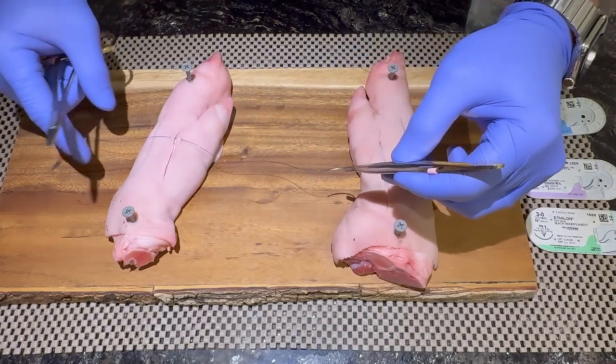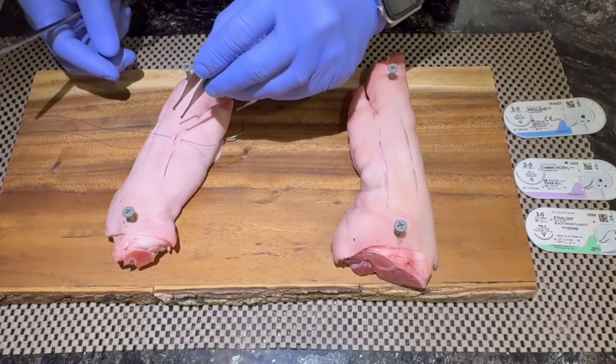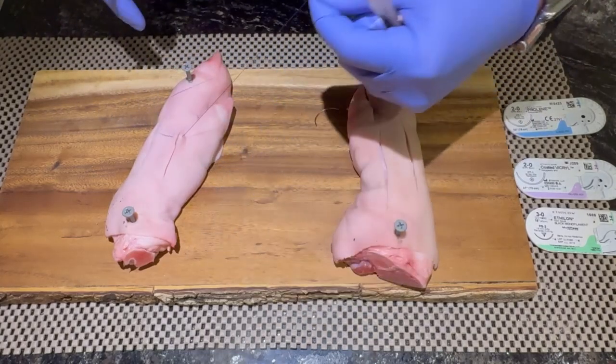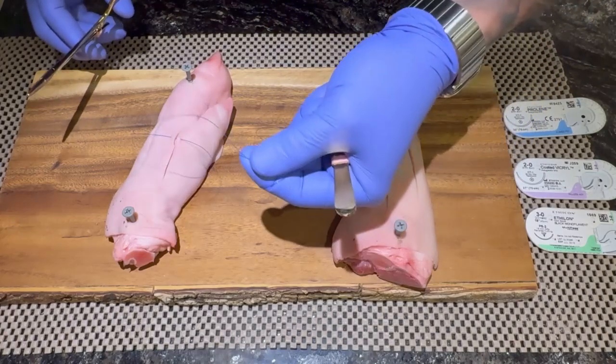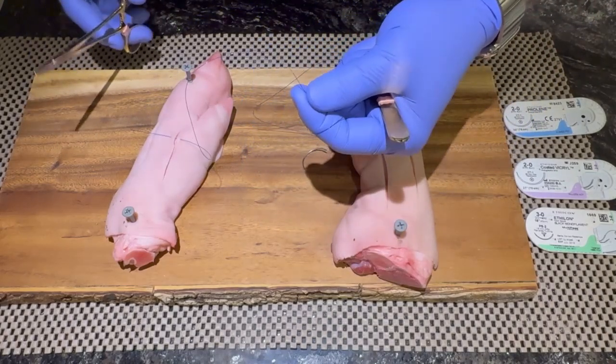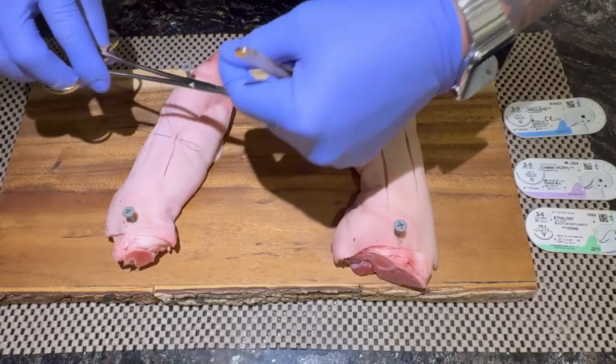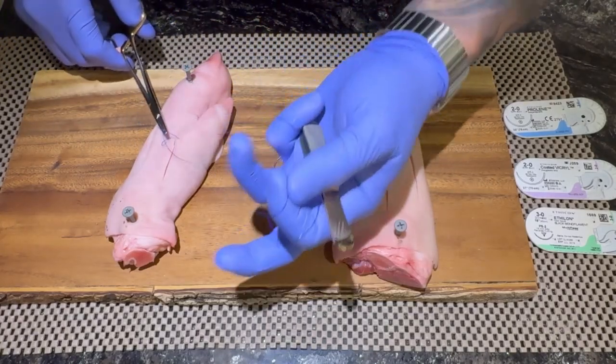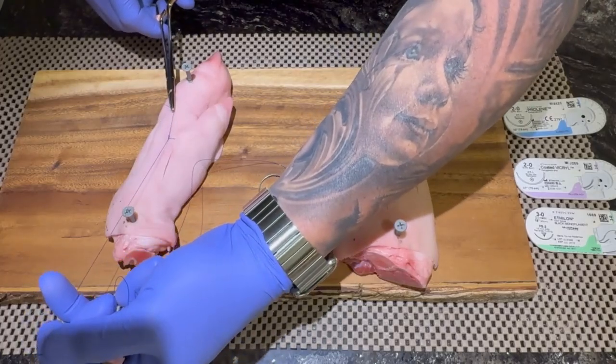We go through, twist the wrist, and come out, going from the inside to the outside. Both areas of the skin should be approximately the same distance. You can pull it through, and then in the non-dominant hand, we hold the suture, and we hold it in the dominant hand. We proceed and do 2 loops on one side, grab the other corner, and tighten the knot.